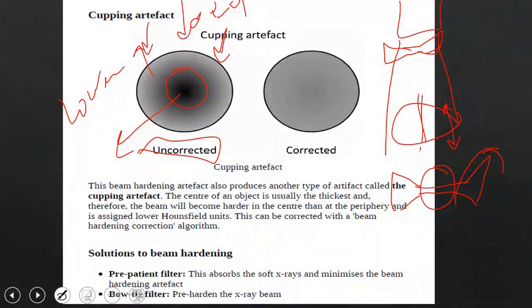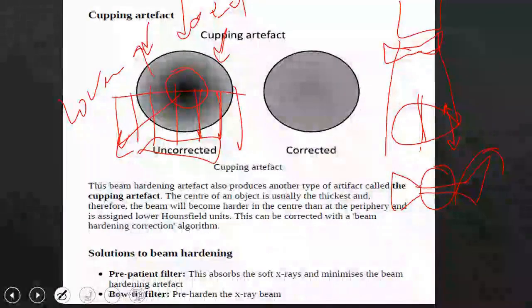If today you connect your signal in a homogeneous or uniform way to the detector, then it will take your grayscale. The intensity values received here will be the same as here, and here, and here, because you are providing your incident X-ray equivalent to the thickness it will encounter.